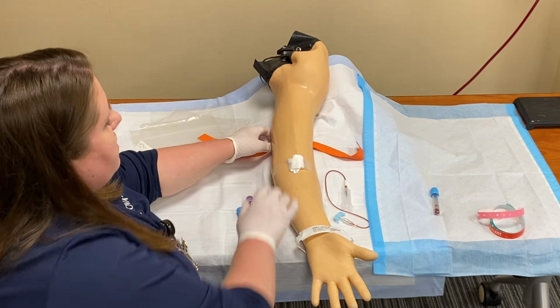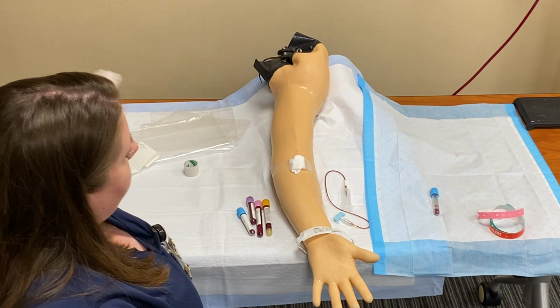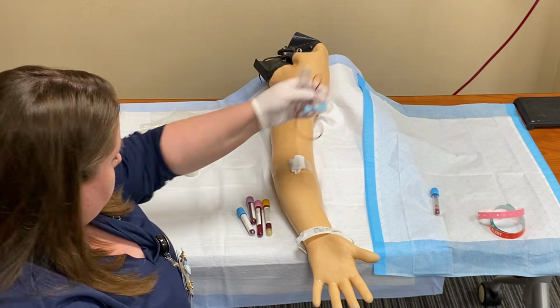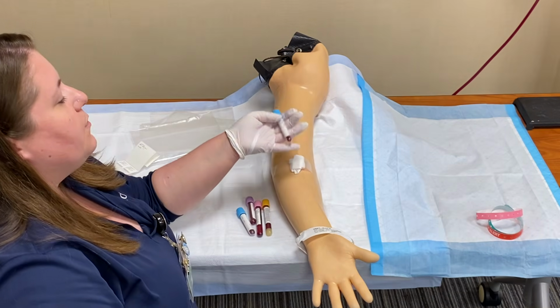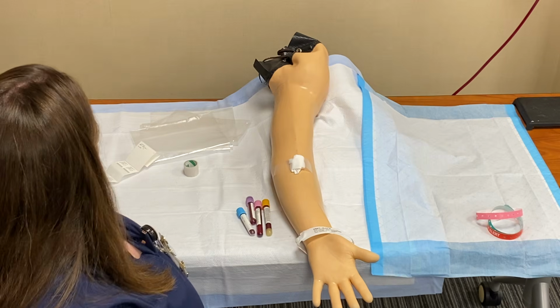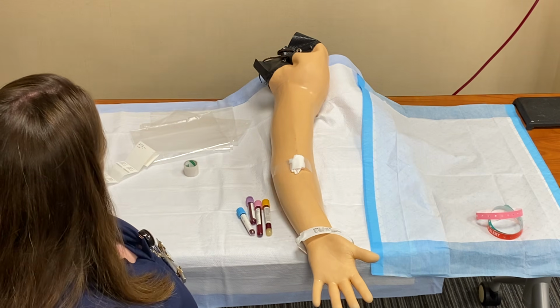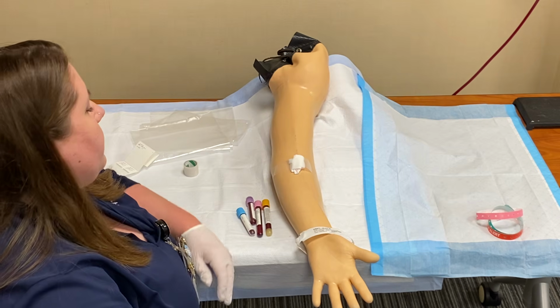My tourniquet always comes out from underneath of the patient. It's one-time use, so I'll throw that away. I want to make sure that my sharps go into the sharps container, so I'll put that in the sharps container. I have a waste tube that has blood in it, so this needs to go into my biohazard container. Any other trash that I have, I can throw away. And I'm going to collect my specimens in the computer.